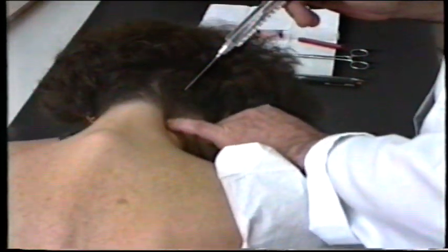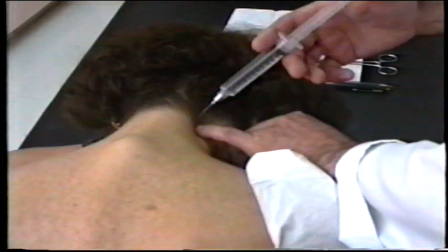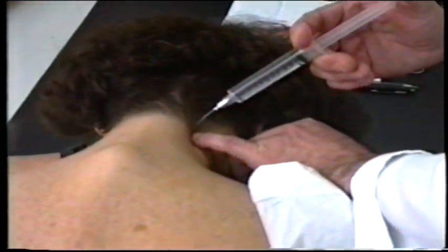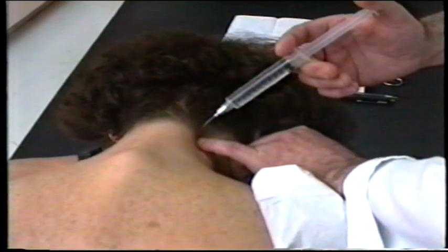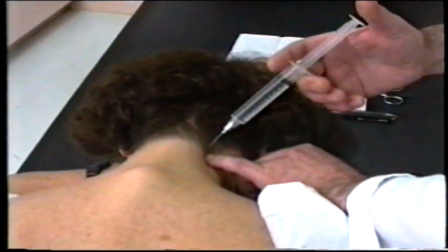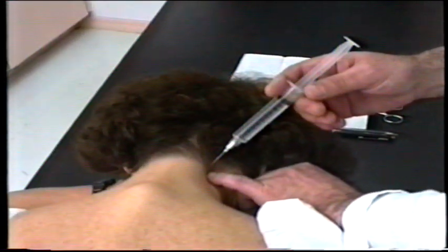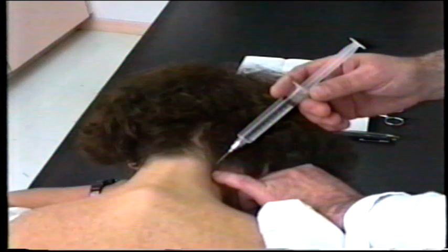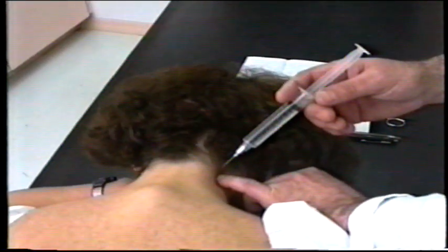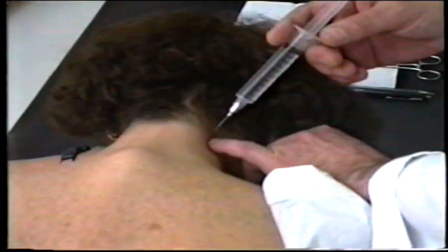This is the one, right? What is that you're injecting? Beg your pardon? What is that you're injecting? Xylocaine. At this point, I'm asking the patient if the pain is gone. Is the pain gone? No, now it is. All right. So you wait for approximately 35 to 40 seconds until the pain is gone. As you can see now, with the needle left in place, please don't move.